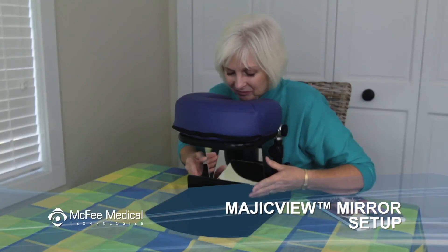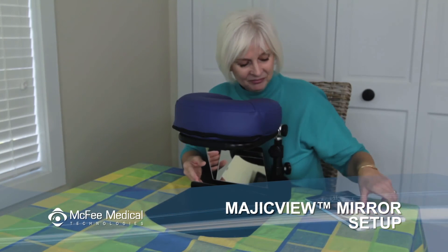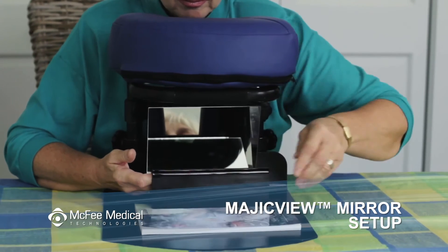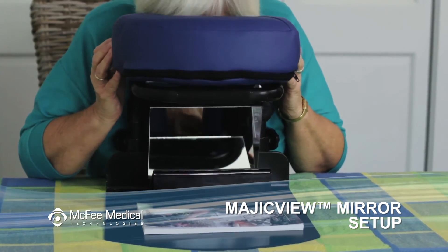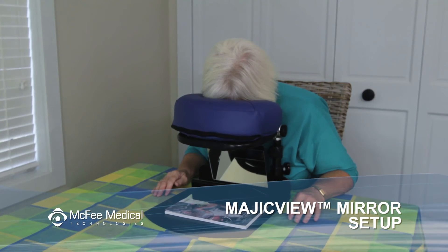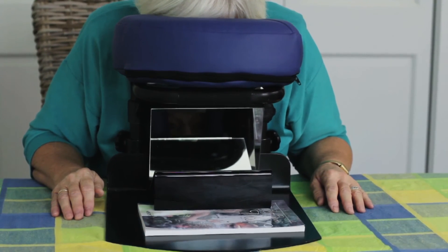Moving the Magic View Mirror forward or backward will move the viewing area up or down. Although it comes preassembled for the best field of view possible, you can adjust the tilt of the mirror with a book or other item. This will allow you to change your viewing area. You may need to adjust the tilt of your face along with the mirror to move the image into an optimal viewing angle.